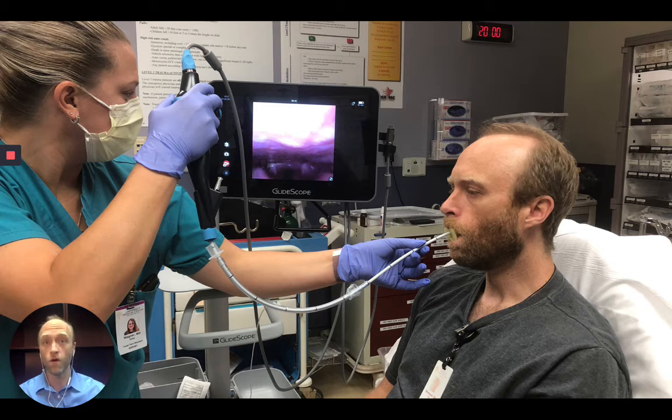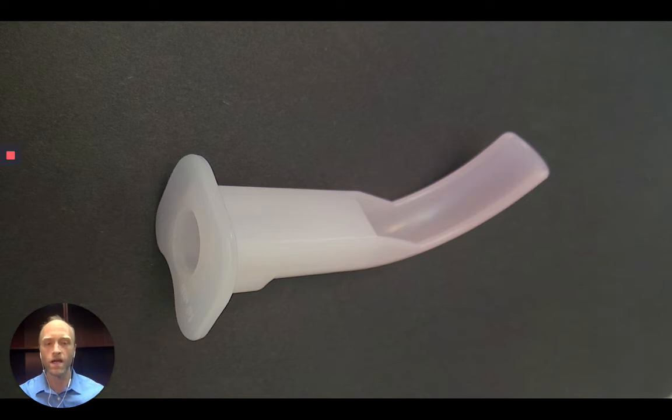So here's a photo of the resident performing the procedure through the oral route. As I already mentioned, it requires greater skill to drive the scope when going through the mouth because the turn is much sharper. An oral intubating airway, such as the Williams airway intubator, can help guide the scope and keep it midline. However, with increasing operator skill, it is not needed. And if you don't have an oral airway, putting traction on the tongue will give more room in the oropharynx to make the turn toward the larynx.